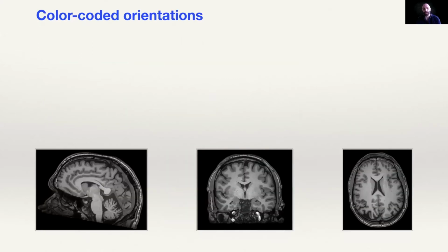Another thing that we use heavily in this field is color-coded orientations. So I would better just talk about it now. So for example, this is something that we call an orientation distribution function, or ODF. It's just one way to picture orientations in a 3D space. So it is a convenient way, and you see that it has colors. And they seem to be linked to orientation, like this vertical axis would be blue, and the XY axes in the plane would be red and green, respectively.